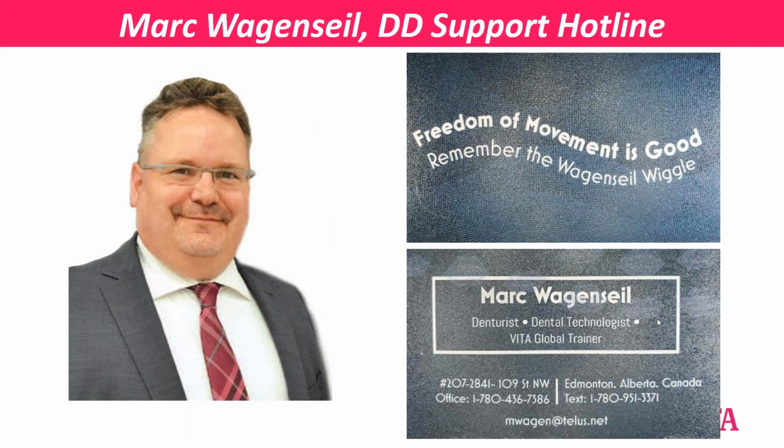Before assuming that the dentist is intraoral scanning edentulous, is there a time period that they have to allow the ridge to relax before they scan it? Okay, so my experience on that is I would really like the denture out. 15 minutes is ideal. There's no studies on this per se. This is more of just, I need to release the pressure on the hydraulics on the ridge. So I'll take whatever I can get.